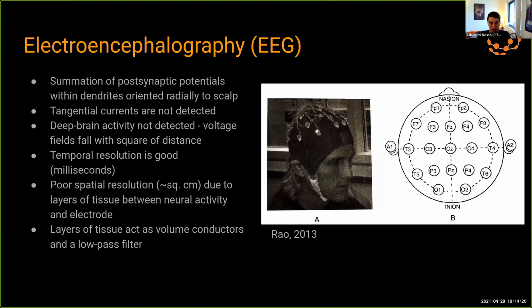So for EEG, we have electrodes that are sitting on the outside of the scalp. So this is a non-invasive technology, no surgery, nothing required. And actually, this is a good time as any to show it off here. This is the OpenBCI Ultra Cortex, which is the structure we've been using for creating BCI. So it sits on the head like this. So very simple to take on and off.